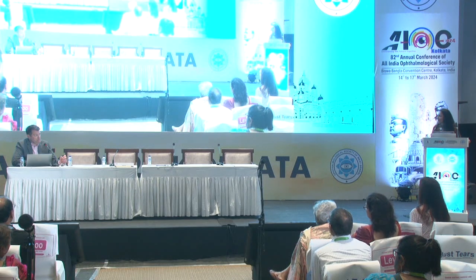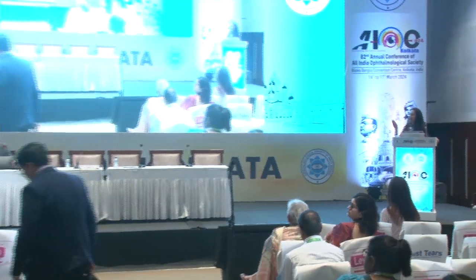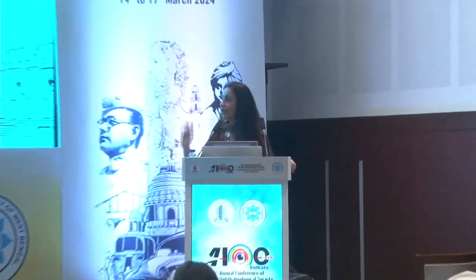So do you have any suggestions for those in the audience who are thinking about putting a toric in a keratoconic? Is there an age cutoff? Are there things you look for in an exam to say, is this person going to become one of those who's going to get that inferior ectasia and therefore may not be a good candidate for a toric IOL? Yeah, that's a great thought. Again, I see those ectasias in the grafts early on after their PKs. So typically when they're in their 60s or 70s and they're getting cataract surgery, if they haven't had that ectasia at that point, they're unlikely to have it. So in those patients, I'm very comfortable doing that.